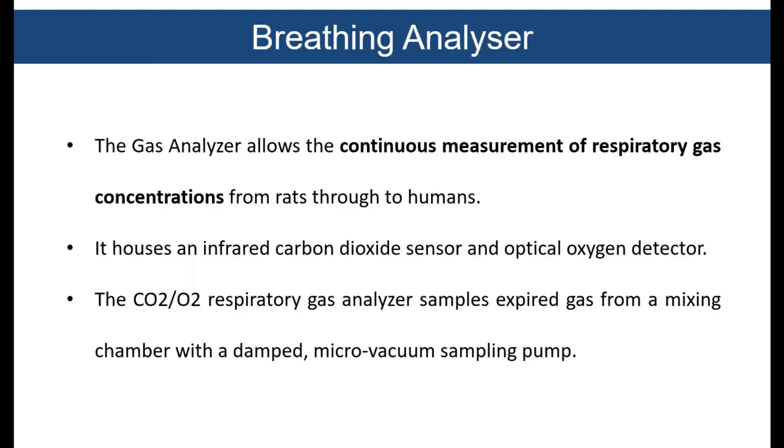Breathing analyzers. Breathing analyzers are basically gas analyzers that allow the continuous measurement of respiratory gas concentrations at various scales. It houses an infrared carbon dioxide sensor and an optical oxygen detector. The CO2 or O2 respiratory gas analyzer samples expired gas from a mixing chamber with a damped microvacuum sampling pump.